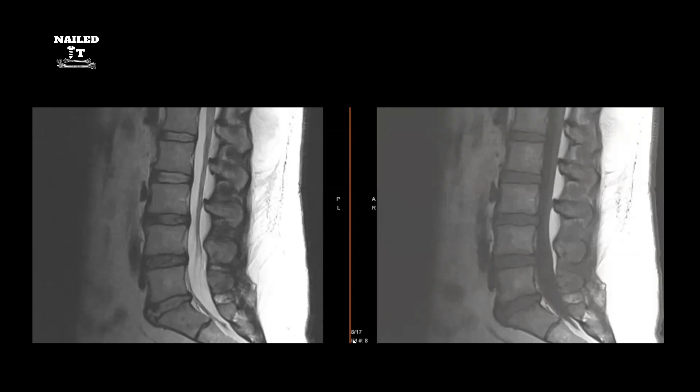There are two types of images you can get with MRI scans: T1 and T2. On T1 scans, fat is hyperintense or bright, and fluid is hypointense or dark. For T2, always remember: fluid is hyperintense or bright. So fluid and fat are both bright on T2, whereas on T1 only fat is bright.